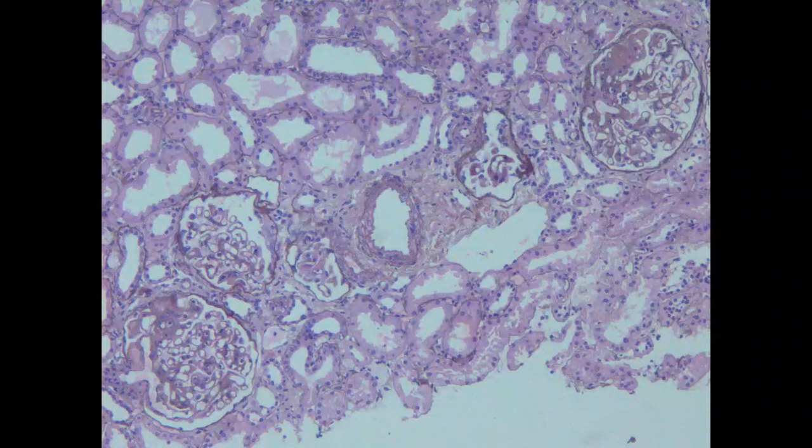So this is just to highlight that only advanced membranous will have a FSGS lesion. It is very uncommon for an early membranous to have a FSGS lesion. You have to remember this.